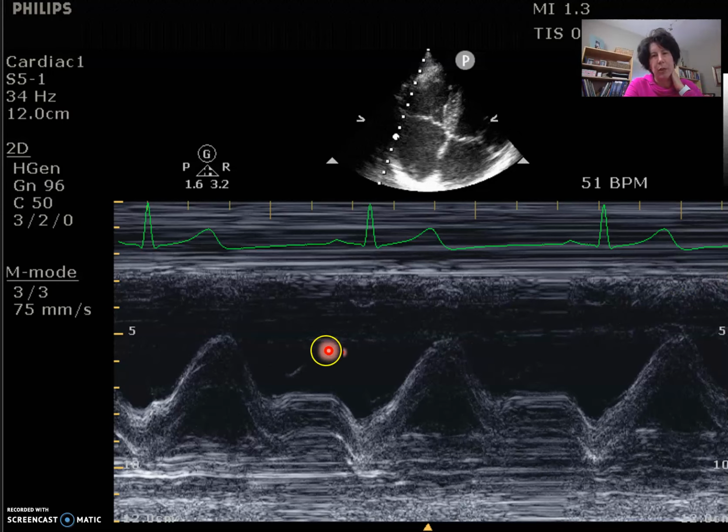You would take that point, which is probably here, measure that during systole and then again during diastole. So you use your ECG, systole and diastole. This is atrial contraction, so not diastole, and look at the difference between them. And for this person, it's probably going to be about 20 millimeters, so 16 millimeters is the normal there.